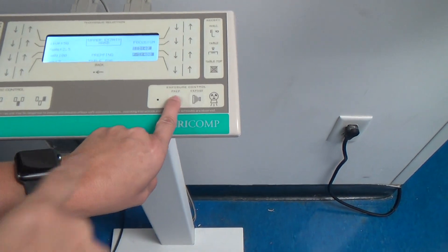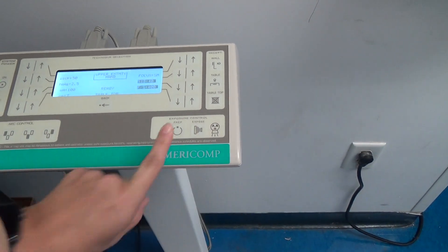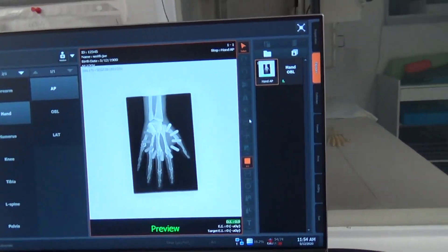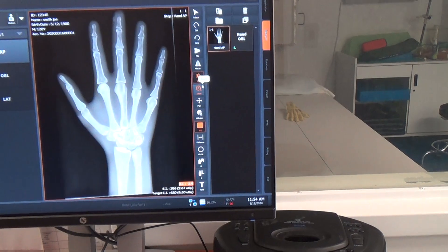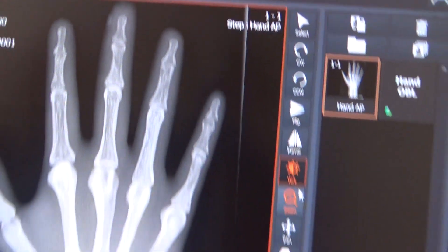So here's my prep button. I'm going to wait until the light stays steady, and then I'm going to hit the exposure button, and then I'm going to take both fingers off. And you can see over here — look how fast that is. Beautiful. And it's perfect, I might add. Job well done. See a nice contrast and density in there.